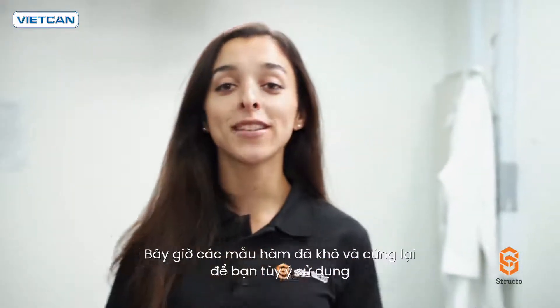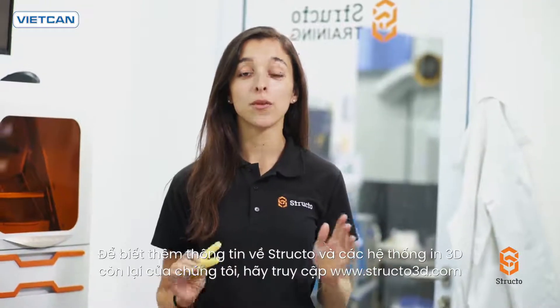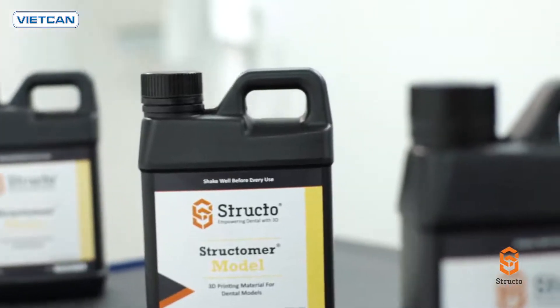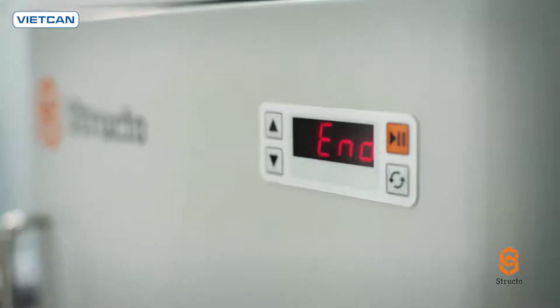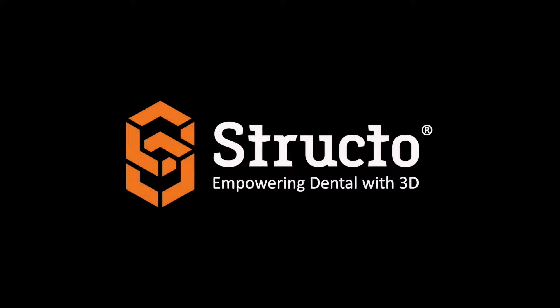The end result is stiff, dry parts that you're free to use as intended. With the Dentiform, making hundreds of these a day on a single printer is easily achievable. For more information on Structo and the rest of our dental 3D printing systems, head over to Structo3D.com.